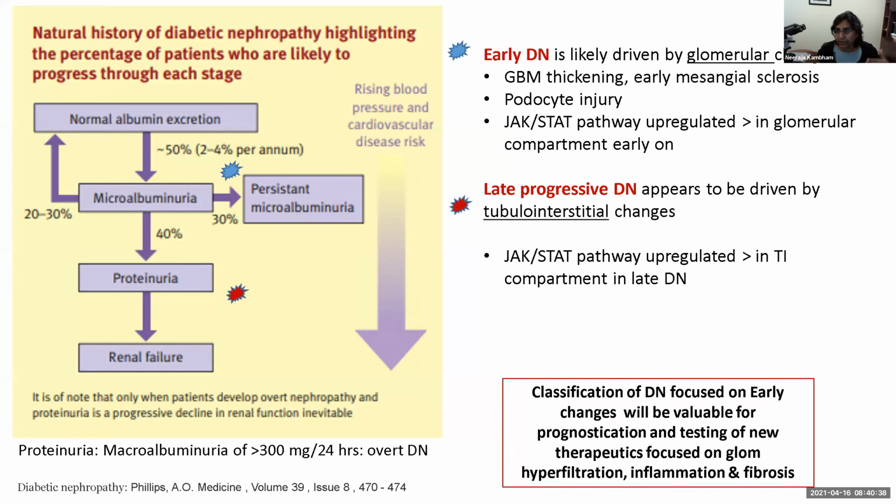How do you determine the early changes? How can you grade them? But that's something that we are always thinking about, and that's what pathologists do. They're all thinking about this as we are looking at the biopsy.